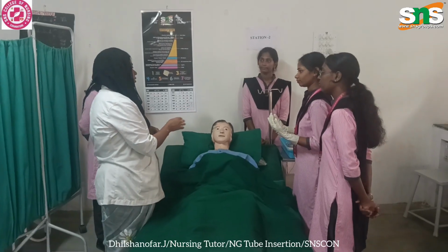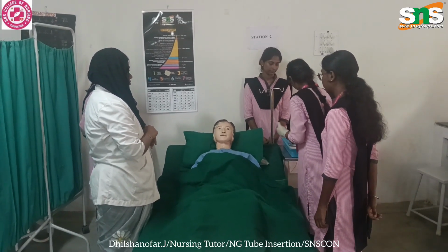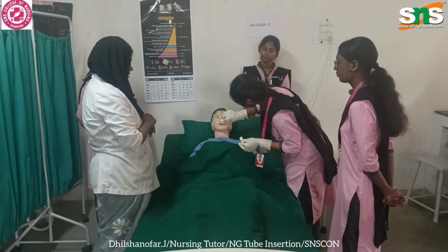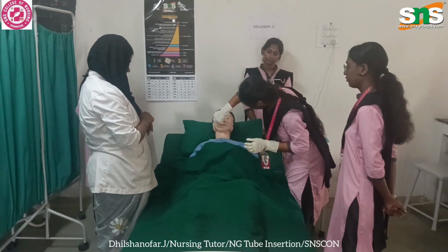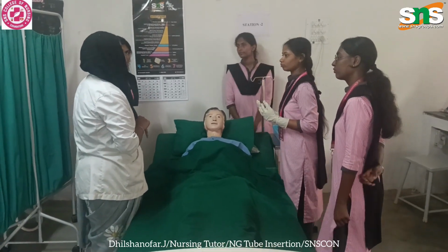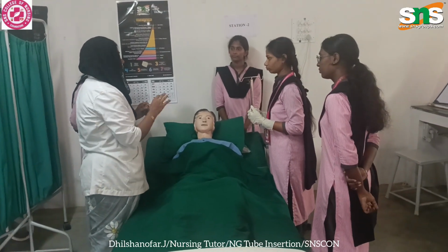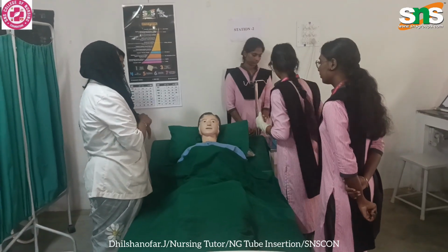You have to clean the nostrils. After cleaning, you have to assess in which nostril the breathing pattern is clear. Only after assessing, you have to insert the NG tube. Now take the NG tube.